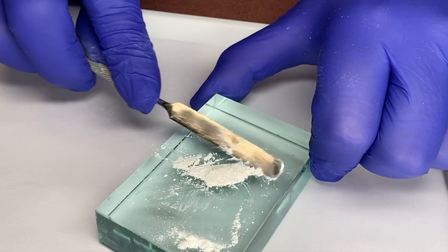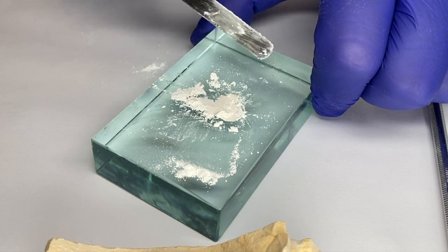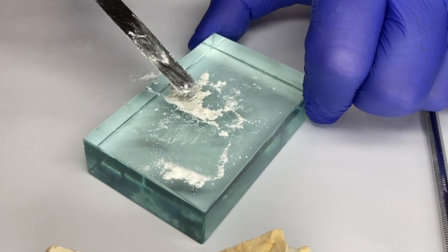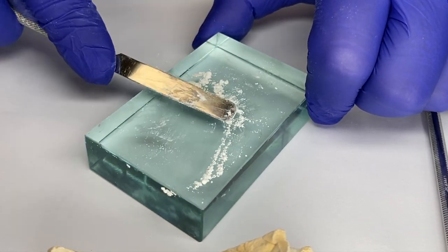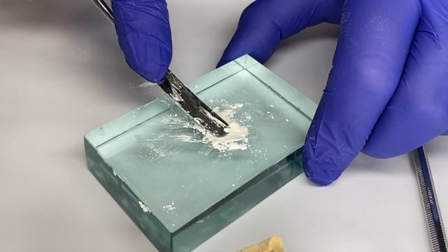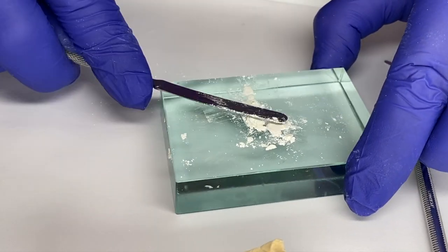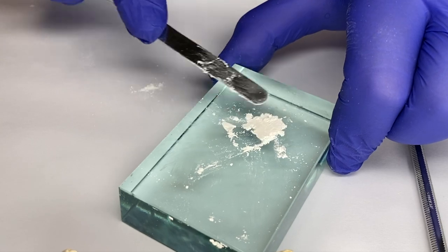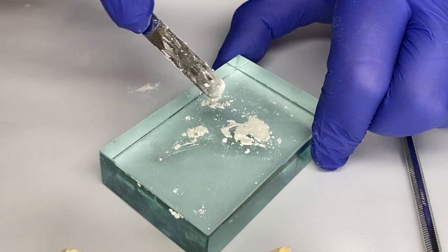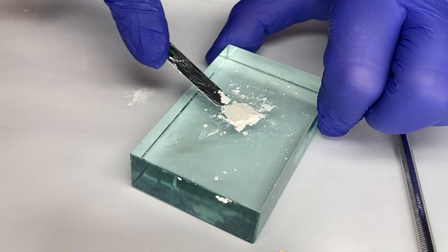I'm going a little slower just because I want you to be able to see how the material mixes. You see how I'm pushing this? I'm not keeping it straight. I'm pushing with a little bit of force. As you get faster and faster with this, it won't take as long to do. I'm just going to incorporate it a little more, folding the bottom over to the top, making sure it all gets mixed in. There we go. Just going to incorporate a little more, push the oil into the powder, and then we're going to roll it into a ball. See how everything gets mixed in there?